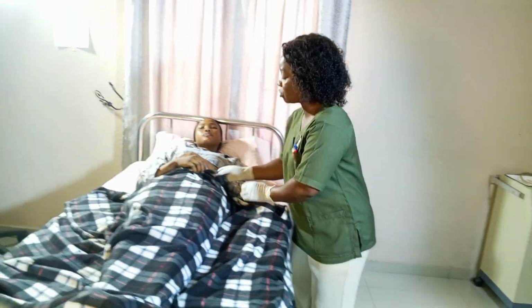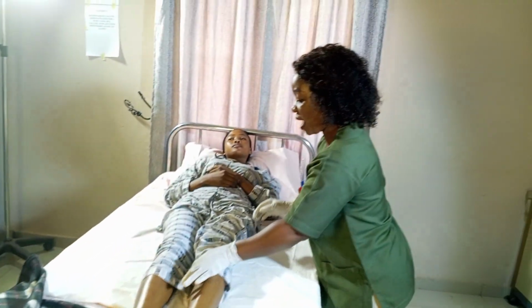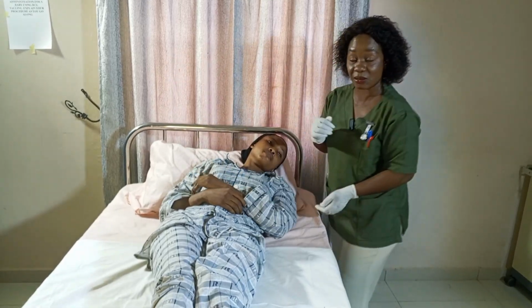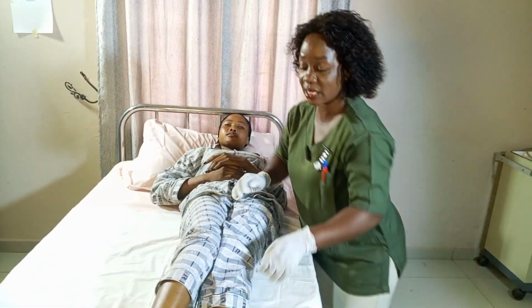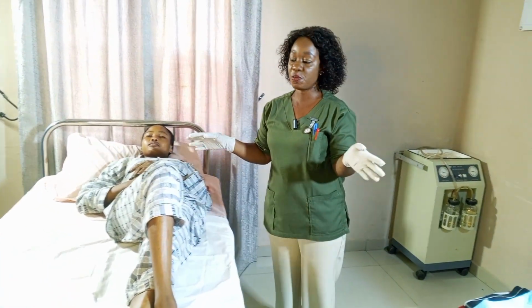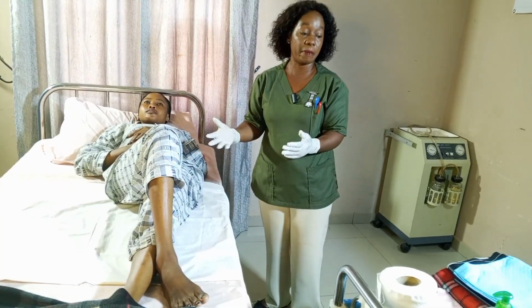So now you have to remove this top sheet, right, away from the patient's body. Then you ask the patient from the shoulder this way, you assist the patient, lift the patient to your side, right, and also shift the patient to your side, and ask the patient to lift the leg and then cross it this way, right? You are trying to prepare yourself to turn this patient towards you to decide where you want to place this bedpan, right?